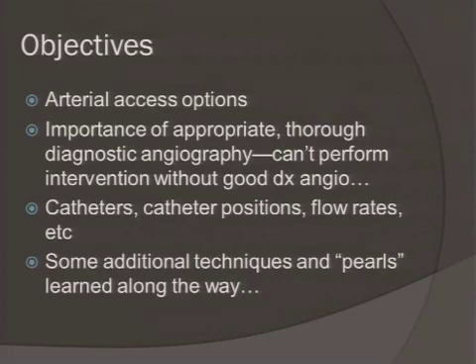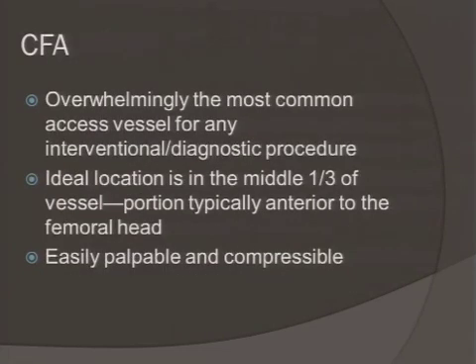And I think the importance of this is not just for the case that you're doing at that point, and it may be something actually quite simple, but for those of you who are at programs where you do a lot of high-end vascular aneurysms and things like that, certainly access becomes critically important because we're doing a lot of aneurysms, the so-called pre-close technique or percutaneous aneurysms. And so it's just basic objectives of what we'll talk about here today.